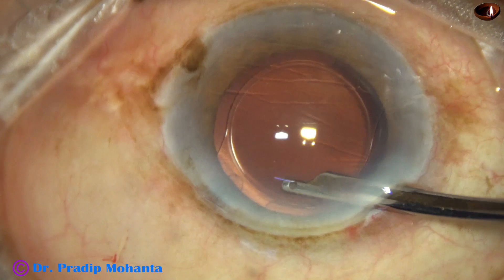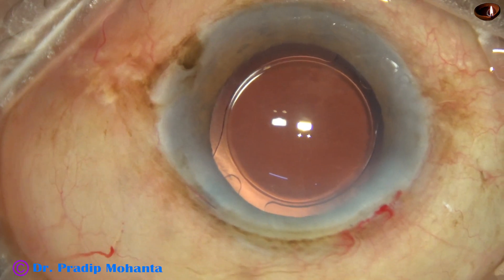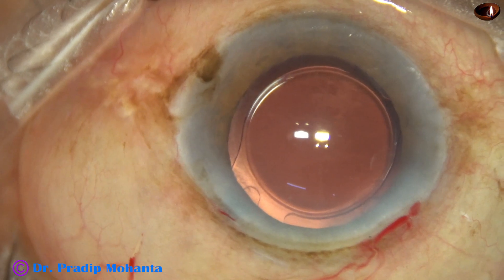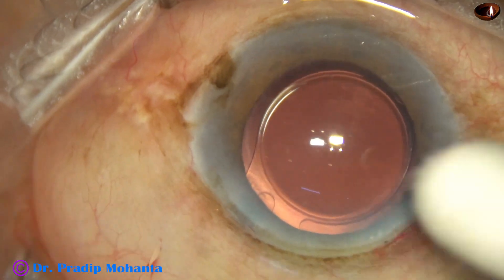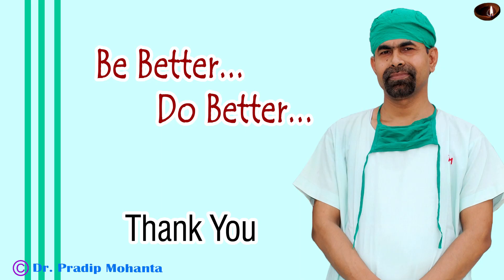I called this patient after 72 hours and these are the post-op pictures. There are very mild Descemet's membrane folds; mild corneal edema was probably present, but it has almost resolved. Intraocular pressure is normal, the anterior chamber is quiet, and the patient is happy. Thank you very much for your attention. Hope this video will help you in developing your surgical skills — be a great surgeon and serve your patients with love, respect, empathy, and great surgical competence.